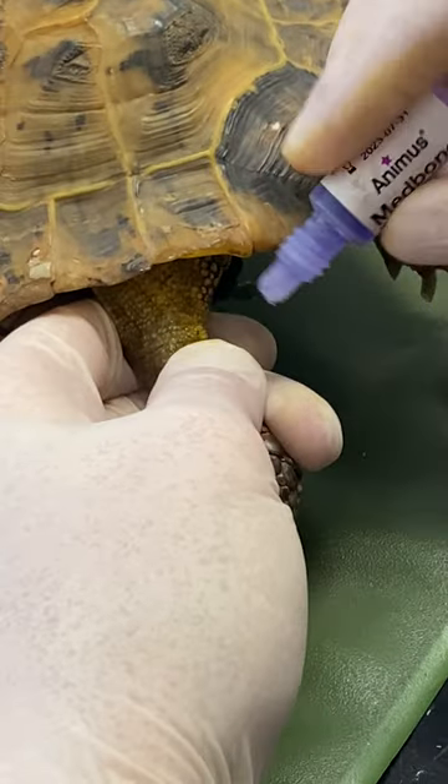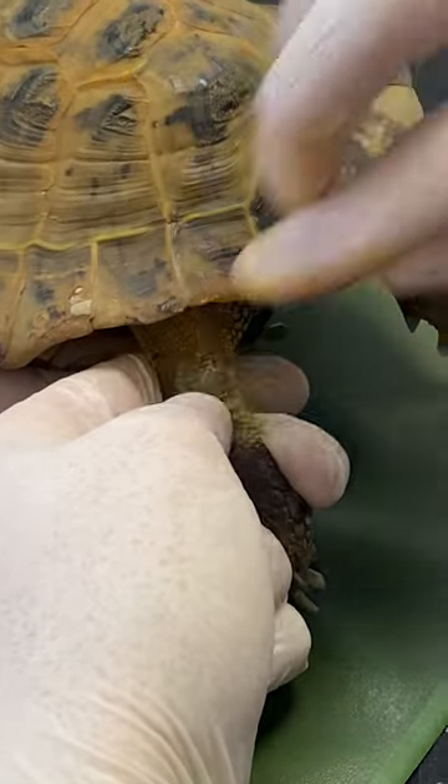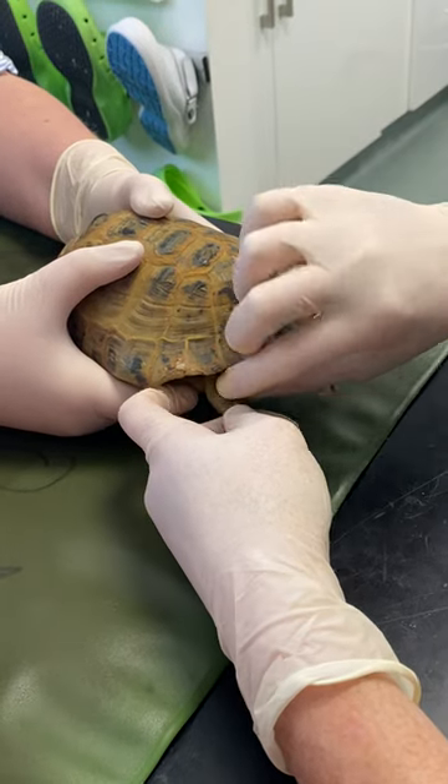We can see the hole — there's no bleeding — so we put a little bit of tissue glue in the area and just stick that skin back down again. Hold the leg out until that glue has air dried.